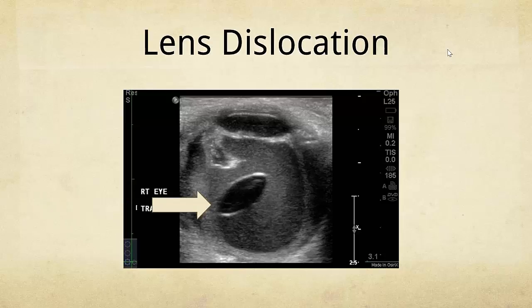And in case you didn't catch that, it's right there. This person also has a globe rupture and a number of other problems.